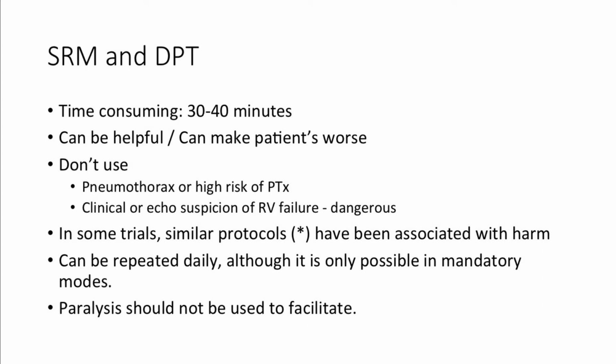So the staircase recruitment manoeuvre, you guys, no one's ever seen this before or done it before. Okay, so the things to tell you is it can take quite a long time. You have to be committed to spend at least half an hour by the patient's bed space fiddling with the ventilator. It can make people a lot better. Equally, it can make people a lot worse. So you have to be prepared to take that gamble.